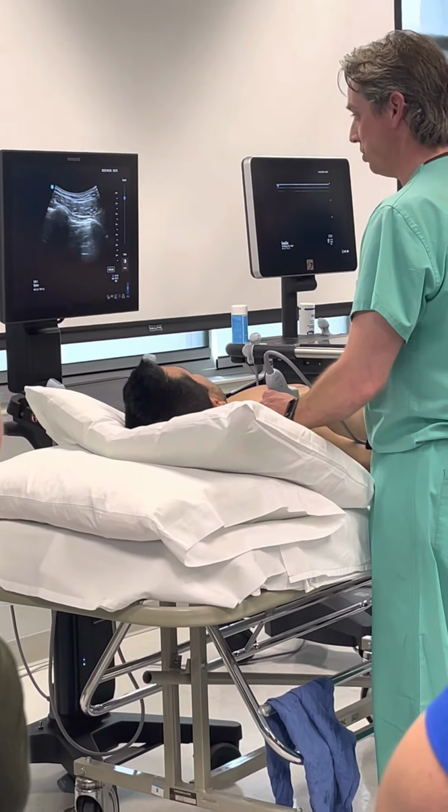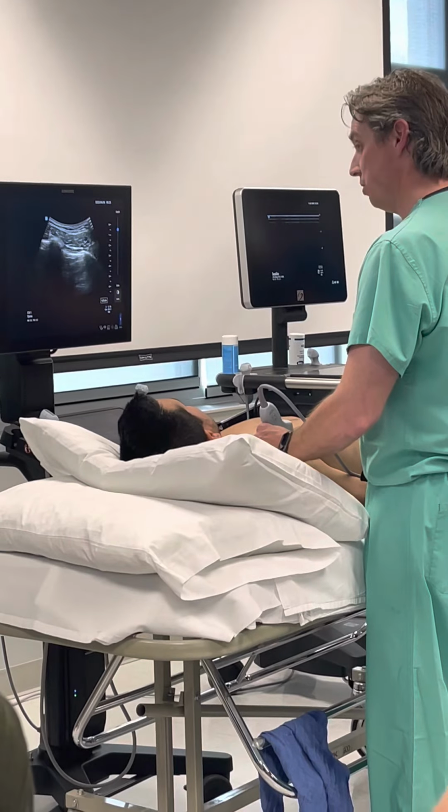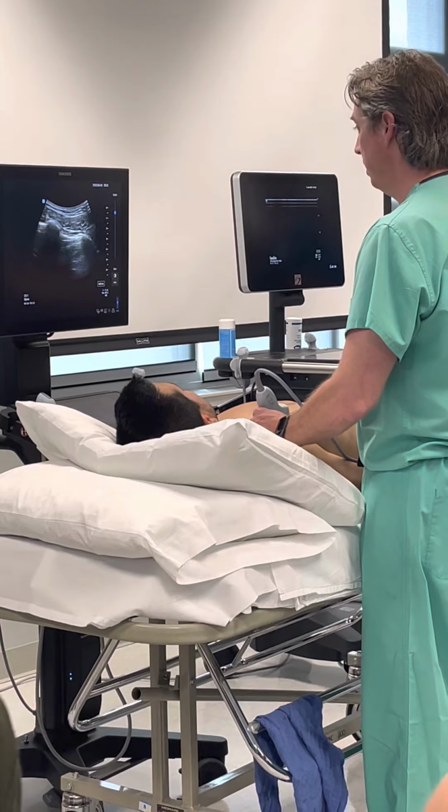But it helps you differentiate what's going on. Why is this person not breathing well? Are they not breathing well because they have a large pneumo, or a hemothorax, or because they've got a pneumonia or an interstitial pneumonitis or something like that?